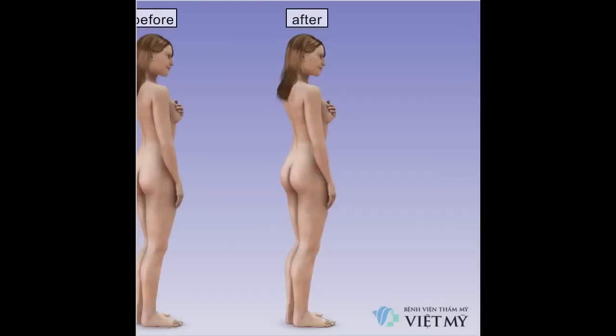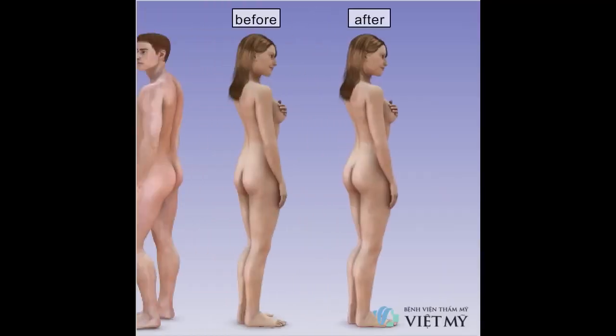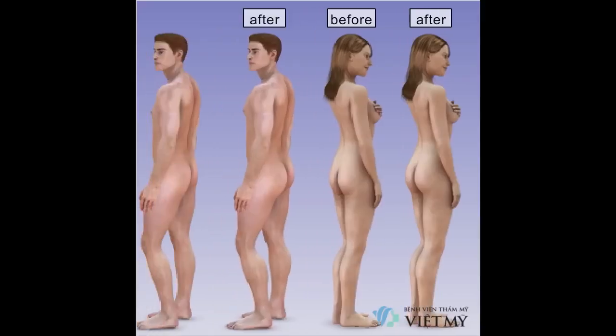You will notice results from body implant procedures immediately. Swelling after the procedure may cause the skin to appear shiny at first, but it will subside within a couple of weeks, and the skin will regain its normal appearance. As the swelling subsides, the area that received the implant will soften and will look even more natural. Your muscle movement should not be affected. The implants are placed so that they are unlikely to shift, and the muscles surrounding the implants will stretch to comfortably accommodate them over the following months.